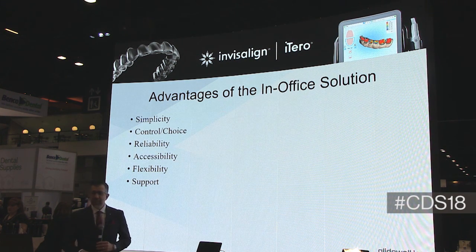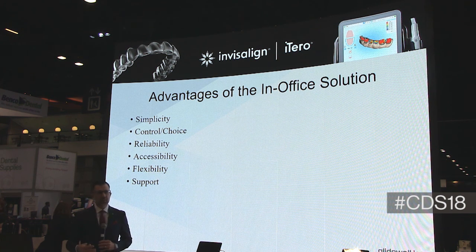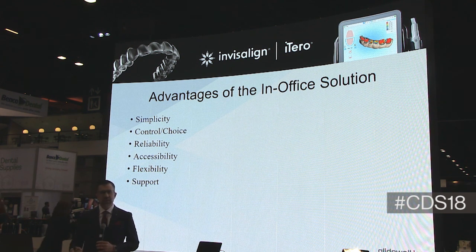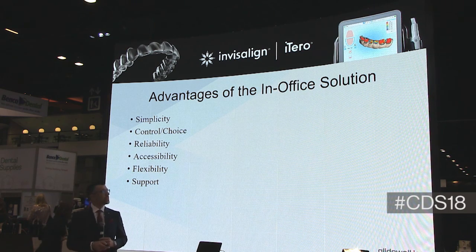The last material before I get to this that we didn't talk about is biotemps. Now that would have been another alternative to the previous case. If I decided to send that case to the laboratory, remember I had no matrix to make that patient a temporary, so I could have milled that patient a temporary in 6 to 8 minutes, placed it in the patient's mouth, if I were short on time, and she needed a restoration that day because the tooth broke. So biotemps is the fourth alternative in the milling solution, and it's a great temporary solution in the office.